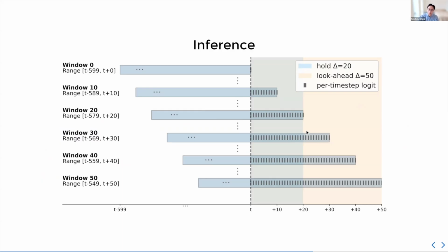And one other thing we employ is that we hold the prediction once we have it for t, we hold it for the next 20 time steps, or a very short horizon into the future, such that first it improves stability. Second, you don't have to do inference 200 times per second. It's more compute efficient. And these two tricks altogether really reduce your flickering to a bare minimum and allow you to use the device online in real time very stably.